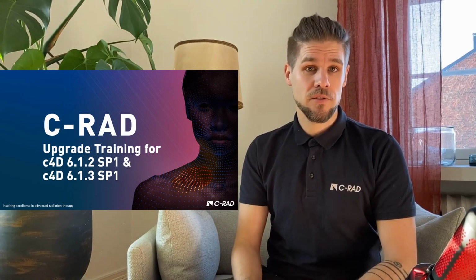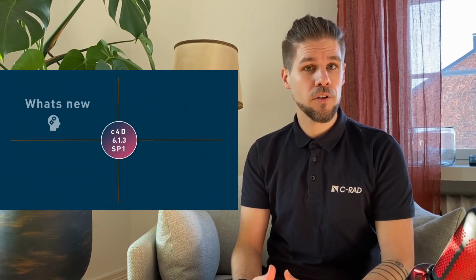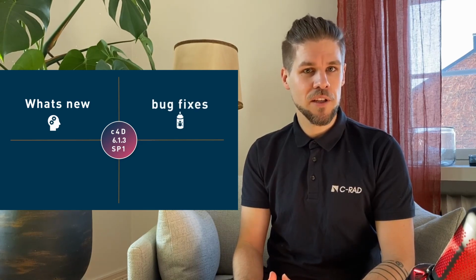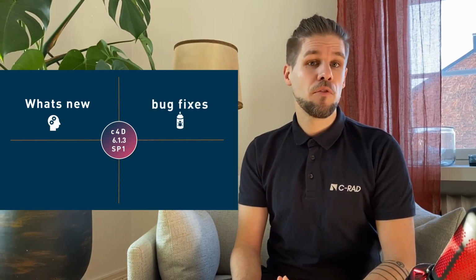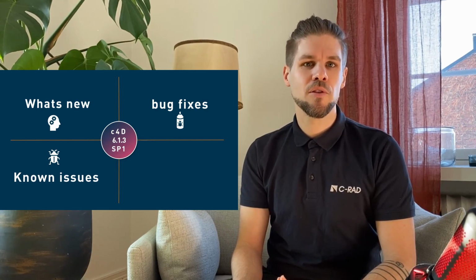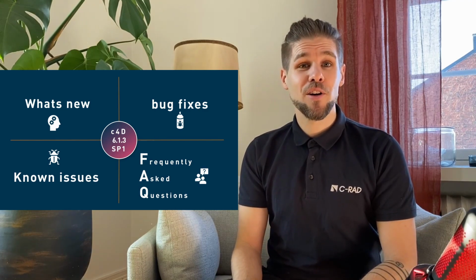And as in the last upgrade training video, we are going through the new features of our releases, of course, and the most relevant and interesting bug fixes we have applied. Furthermore, the known issues, and last but not least, some of the most frequently asked questions that you might ask yourself about the upgrade progress. So let's grab a coffee and enjoy the interesting part.